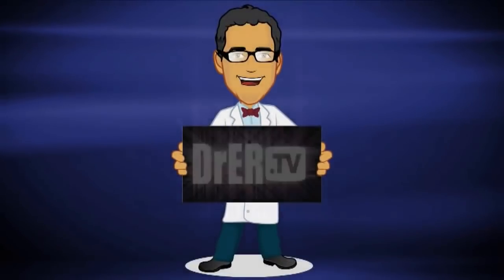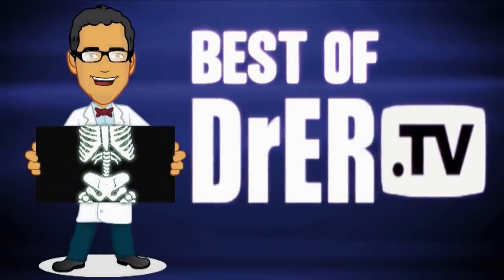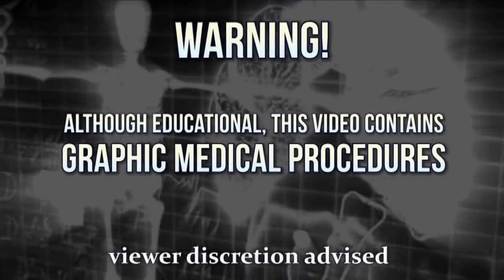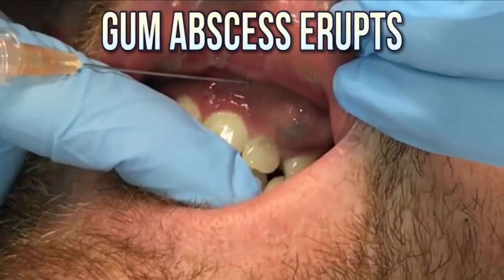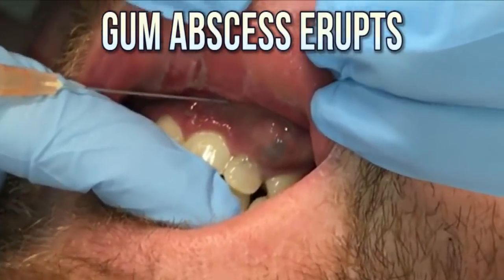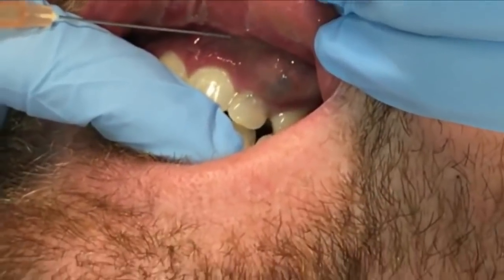In this procedural video, we're going to demonstrate the incision and drainage of a gum abscess. This patient presented to the emergency department with initial facial swelling and swelling of the upper lip.